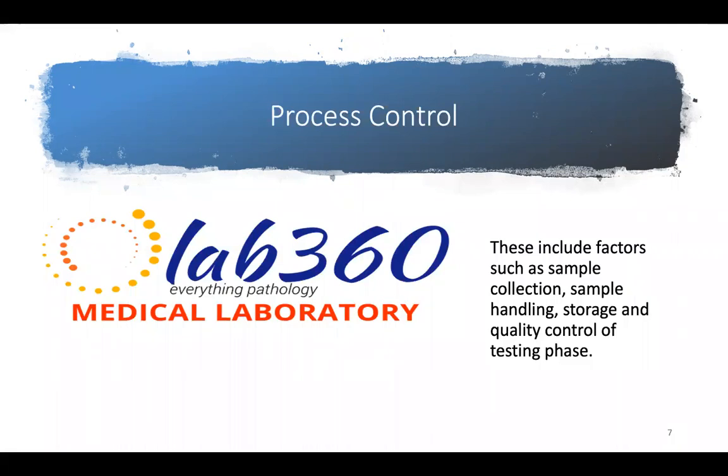Each test has specific bottles that are used for its collection. So the right test must be collected in the right bottle from the right patient. And these samples must be handled properly, because at this stage it's quite crucial, as it could affect the outcome of your results.